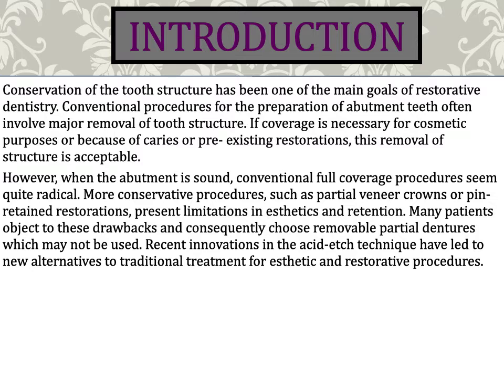However, when the abutment is sound, conventional full coverage procedures seem quite radical. More conservative procedures, such as partial veneer crowns or pin retained crowns, present limitations in aesthetics and retention. Many patients object to these drawbacks and consequently choose removable partial dentures, which may not be used. Recent innovations in acid etch technique have led to new alternatives to traditional treatment for aesthetic and restorative procedures.